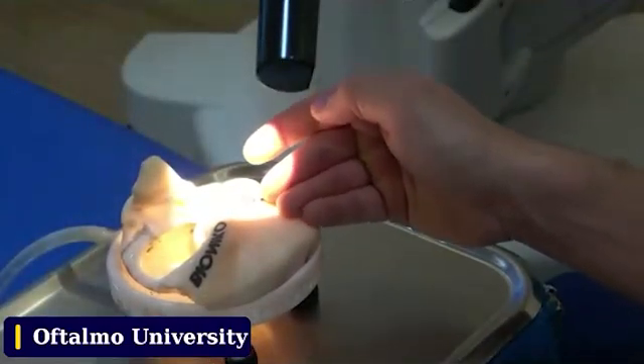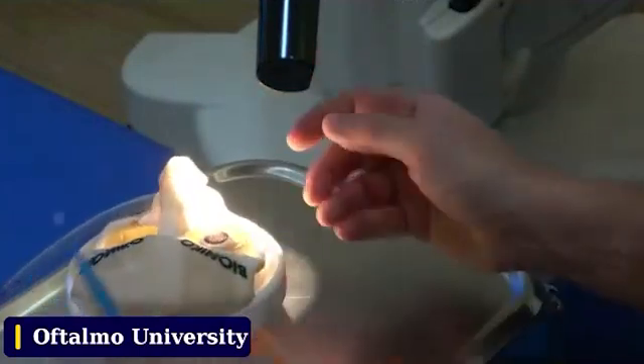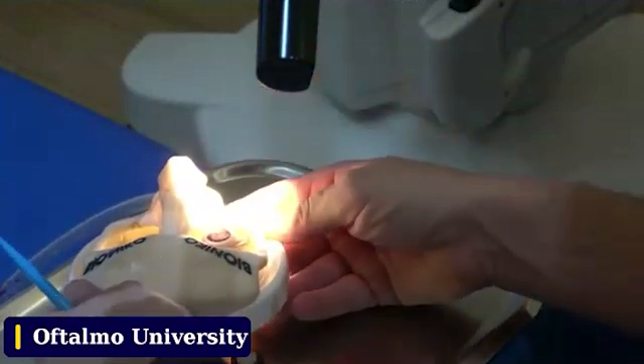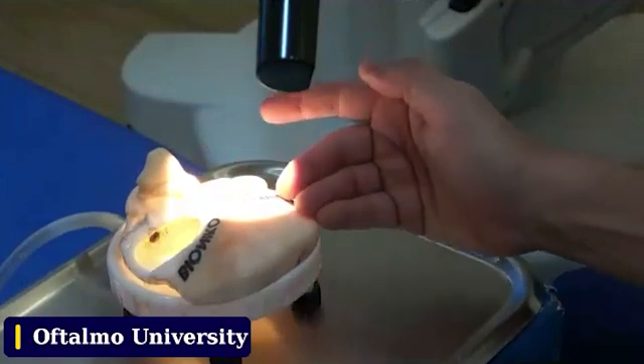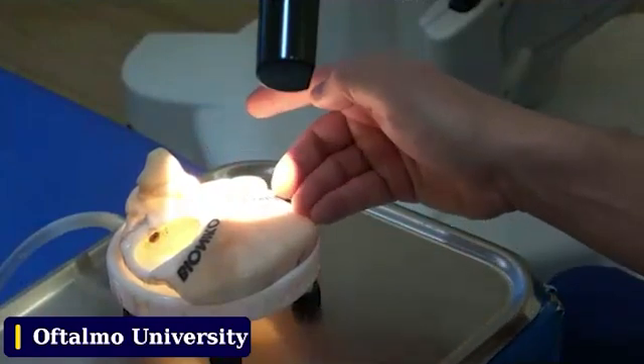This is going to be your fixation point. If you need to do it temporarily, you're going to have a similar approach with a fixation point. It's extremely important to have a correct incision after establishing the fixation point.